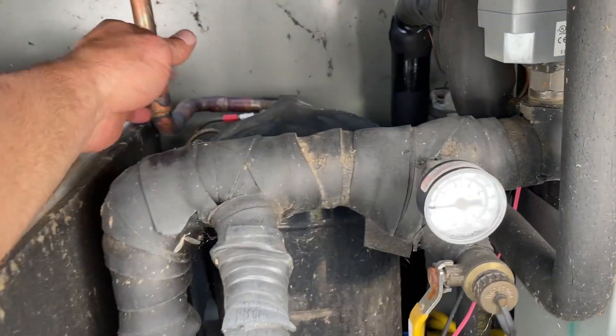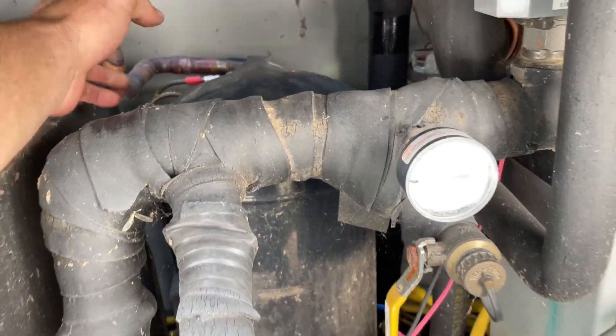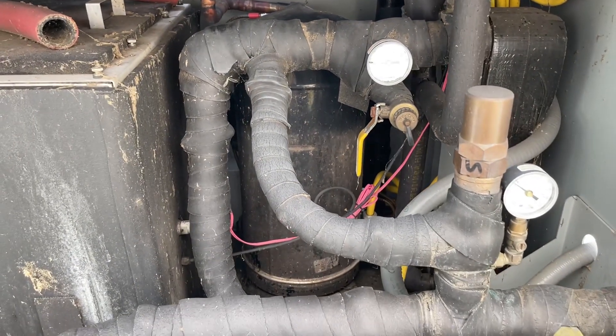The compressor is not running at all, so I need to find out why that is.